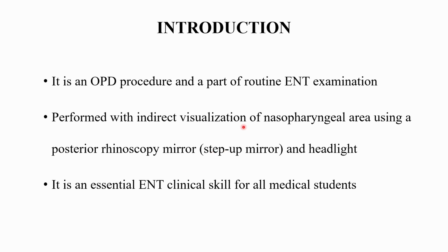So this is a step-up mirror, and obviously with a headlight to pour the light inside, which reflects on the mirror, and we will be able to visualize the structures. It is again an essential ENT clinical skill, like indirect laryngoscopy, for all medical students, and they should know how to perform it.